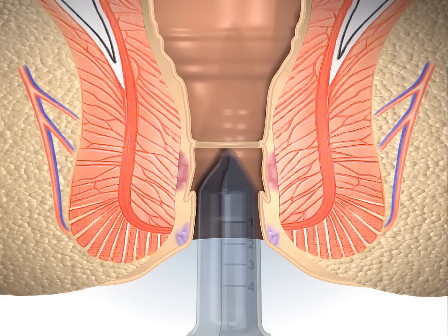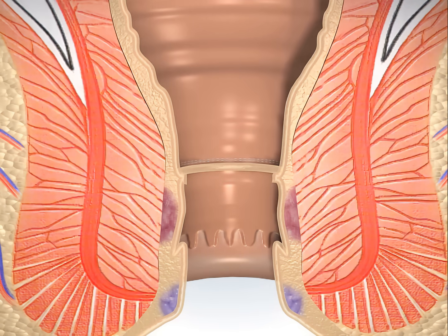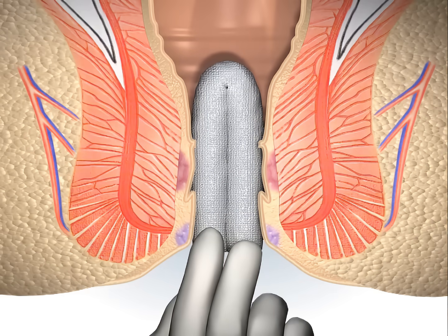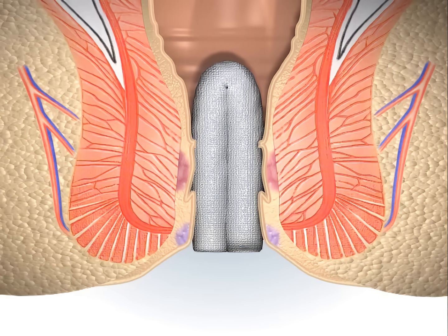The purse string suture anoscope is reinserted to facilitate the inspection of the staple line and application of sutures to any bleeders. Some surgeons may use spongostan-like products to improve hemostasis or a catheter to detect late bleeding.